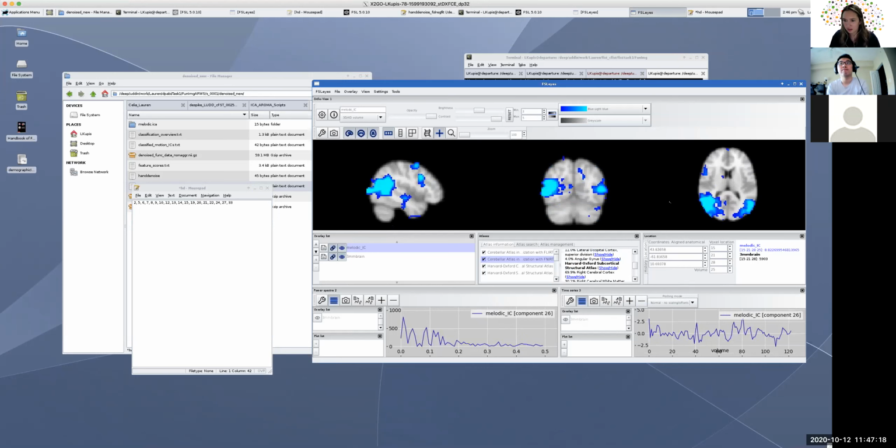Okay, so this one looks like a more clear signal, but it's good to double check, because sometimes it will look like signal but be in white matter, and then we don't want that. Okay, so looks good so far. Good. Okay, a little bit mixed, so I'll probably zoom in just to double check. Okay, cortex. So that one would definitely be signal, which is good.